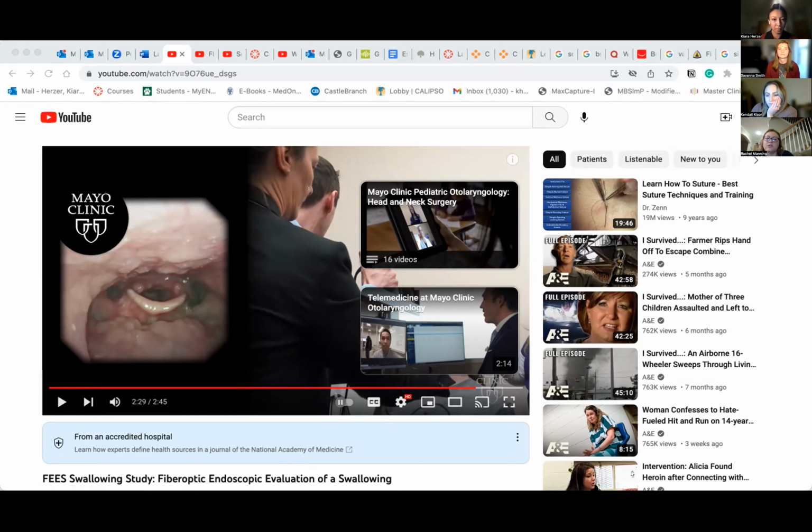Hi, I actually have a question. I'm Savannah's cousin, and I just had a few follow-up questions. Are there any side effects of a FEES study that I should look out for? Yes, well, in some patients, the study can cause a nosebleed or sometimes discomfort. And then in some, it could cause gagging or vomiting and some brief airway closure, which is called a laryngospasm. And then lastly, aspiration in some patients.